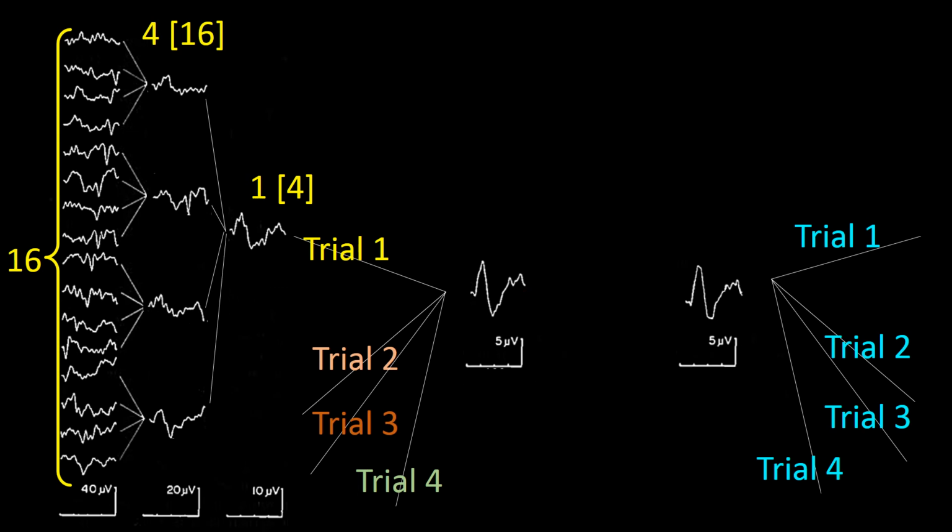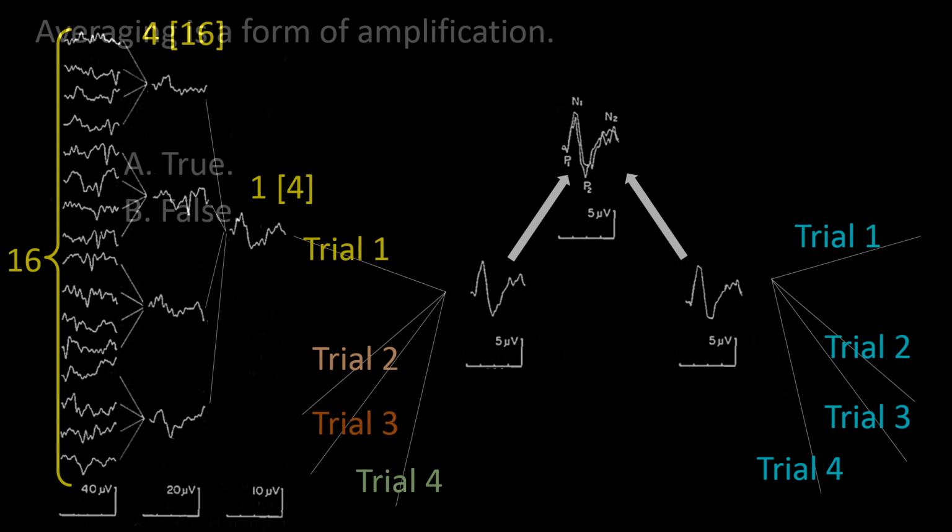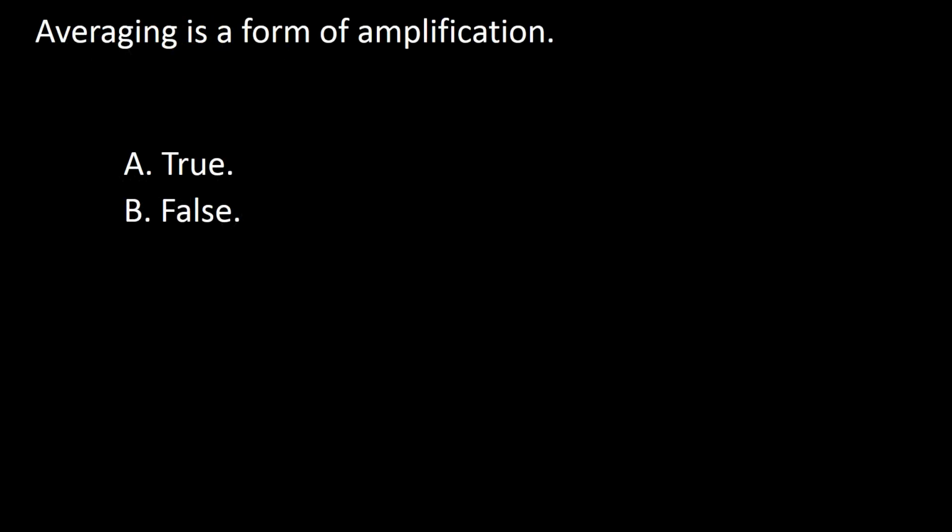Normally, a second independent bunch of trials is conducted to confirm the fidelity of the recording, and this is confirmed by demonstrating their replicability. In this frame, we have added both trials in order to see replicability, and as you can see, it is there. Both are interposed and are rather similar. So the answer to this question is A.